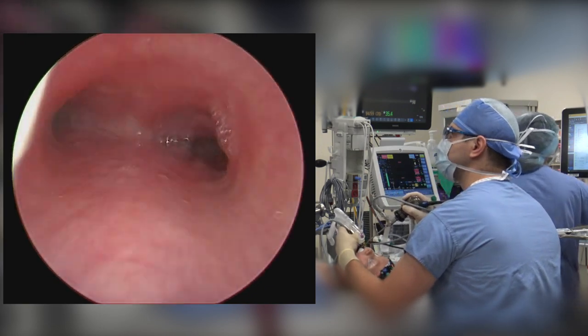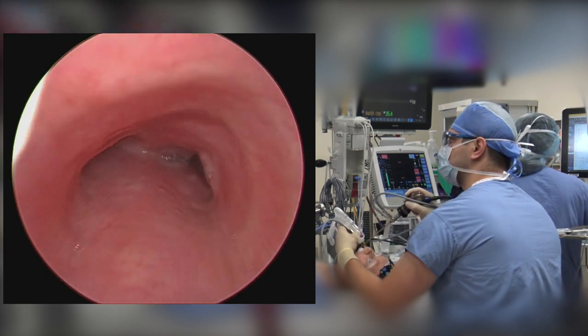As the telescope is withdrawn, careful examination of the mucosa is performed.